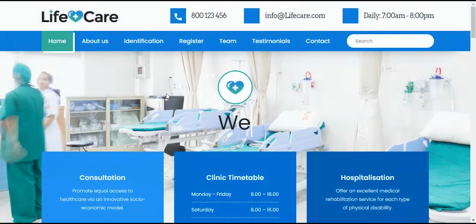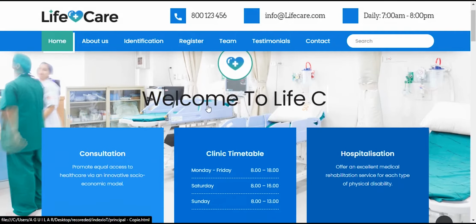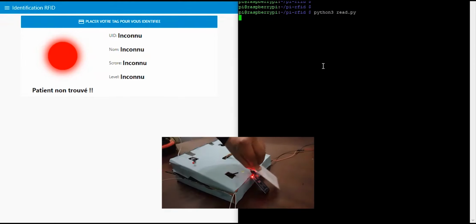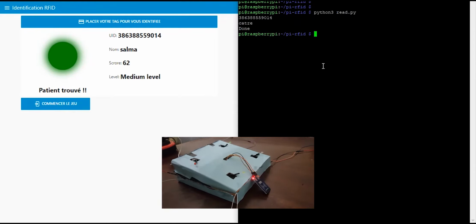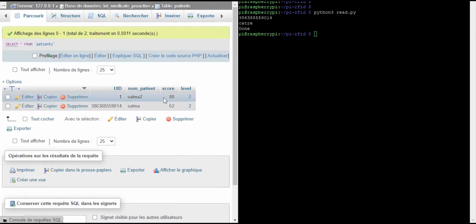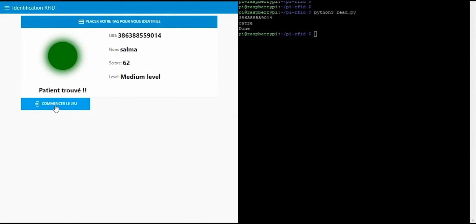We have used Node-RED for our web server and Mosquitto, a message broker that implements the MQTT protocol. We receive the topics from the Raspberry Pi. Each component sends its own data. For example, the RFID component scans the data from the card, and this data is sent through the broker to the server. The server checks if this data is available in its database. If it's the case, a welcome message is announced, and you can access the platform to start the exercise.